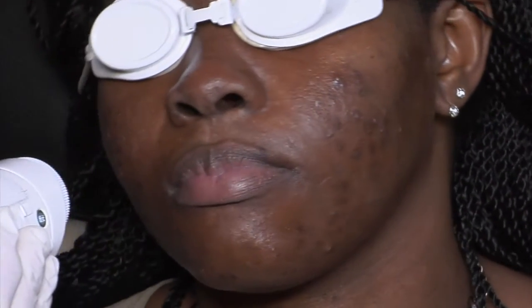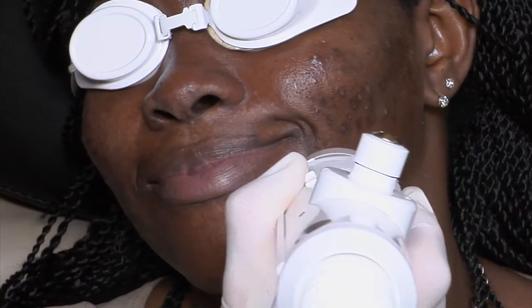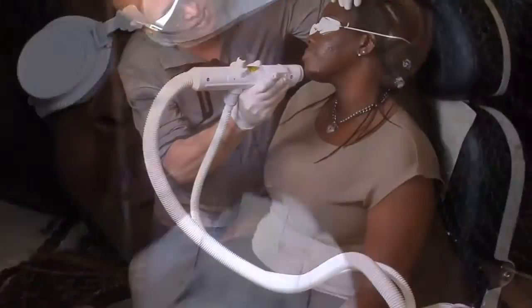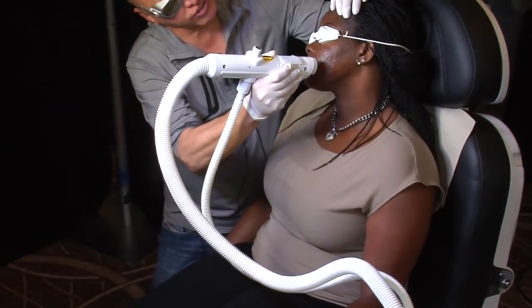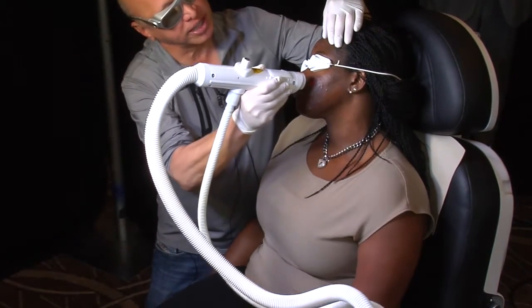I'm going to avoid her eyebrows because she might get hair removal there. I'll avoid her scalp. She has a little bit of a scar in her left cheek — we're going to build a little collagen below that, too, so it may help that as well.